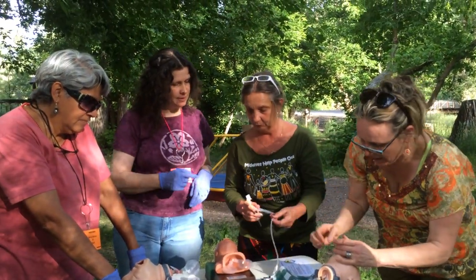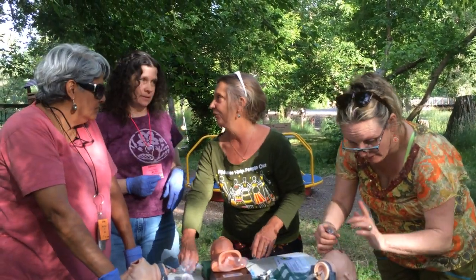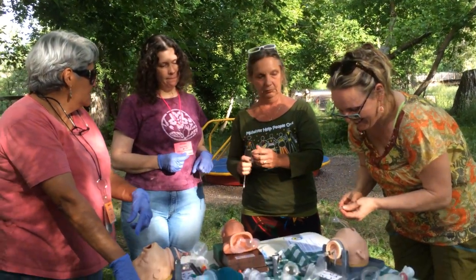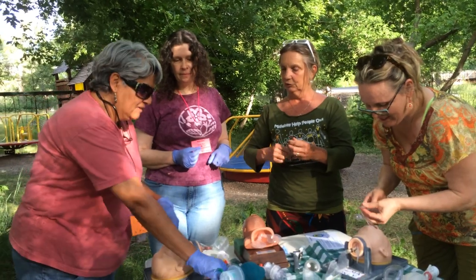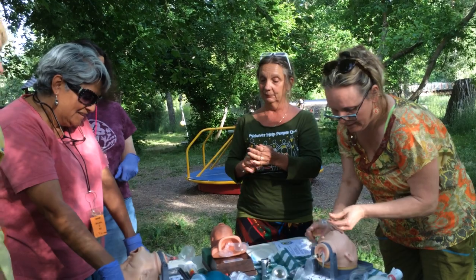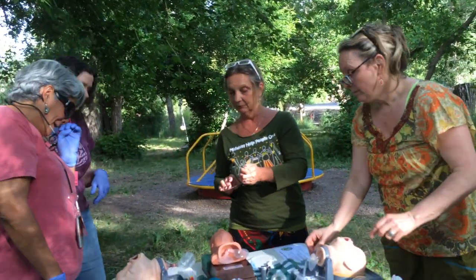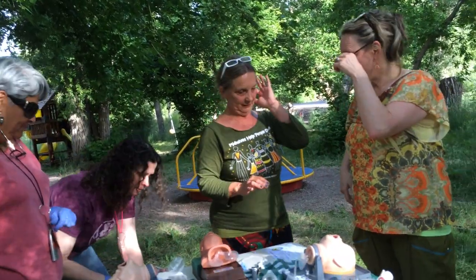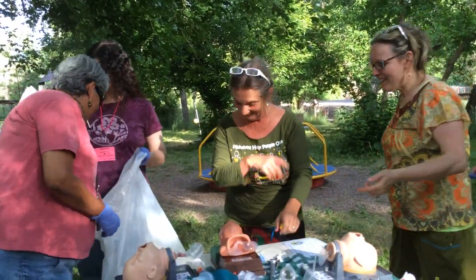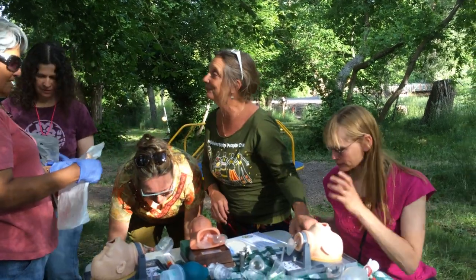Normally, if you intubate the baby and get the baby going, you would not extubate the baby and say, oh, I got it now, and then remove what got you there. So if you place an LMA because you are not able to get that heart rate above 100 any other way, and you get it above 100, you're like, hooray. But some people say, okay, now take it out. No, that's what got you there. Don't take it out. Baby can spit it out, fine. If the baby's vigorous enough to spit it out, fine.